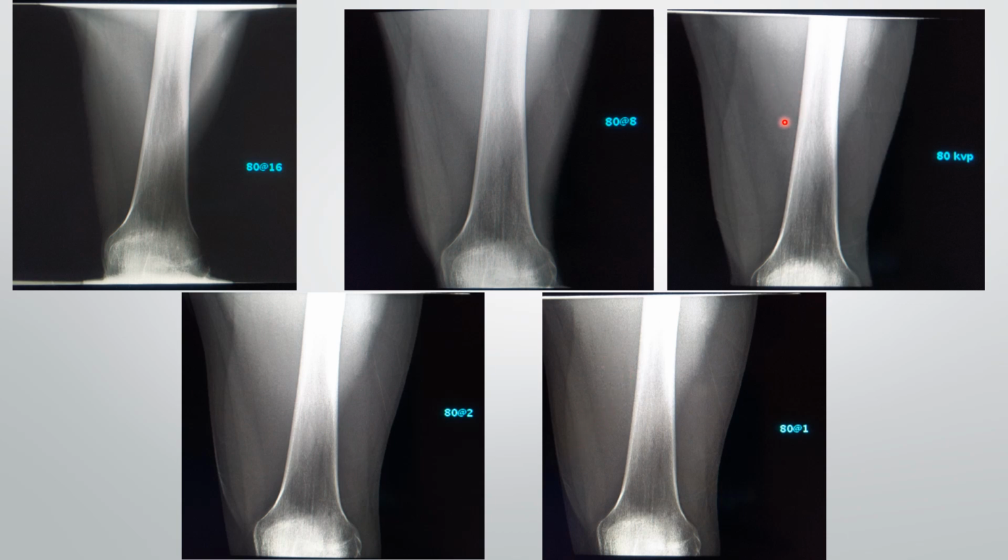Where when we get to here, we can really see these muscles right here, well represented, okay? And when we get to here, it's too much, okay? And each time we're doubling the mAs. So this is how mAs will affect the final image, a representation of it here.